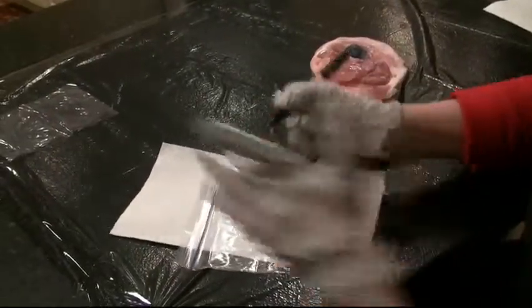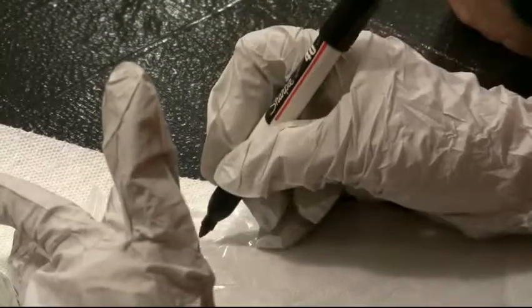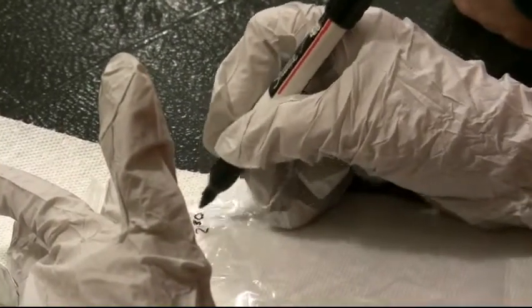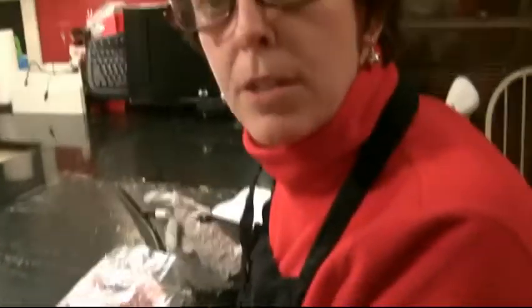I'm also going to put the orientation of the wound. The wound is at, I'm going to call that 2:30, okay? And then I'm going to make sure that I put 12 o'clock up here at the top and 6 o'clock here at the bottom, just to help me stay oriented, okay? So first thing I'm going to do is put this directly over the ham hock here. And I'm going to draw everything down. So I'm going to take a break while I do that, and I'll be back to show you the results.